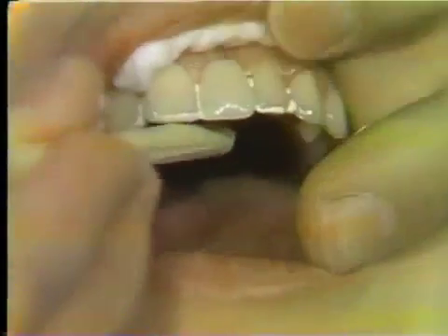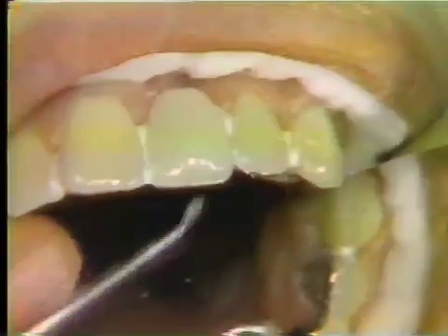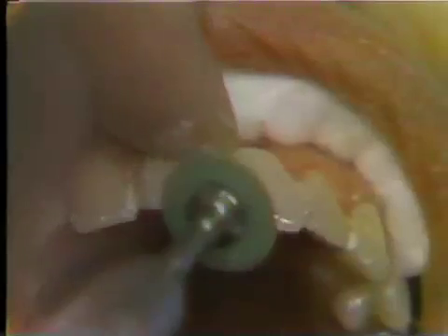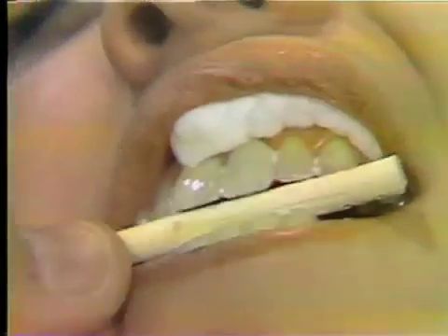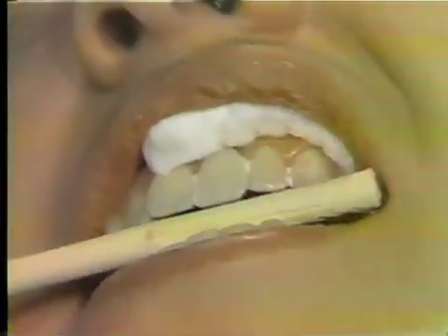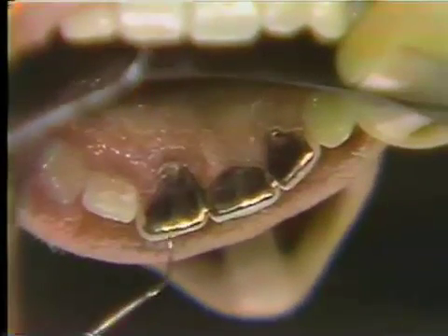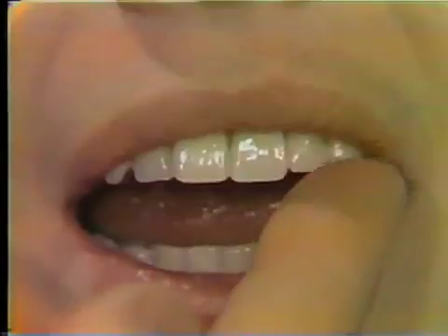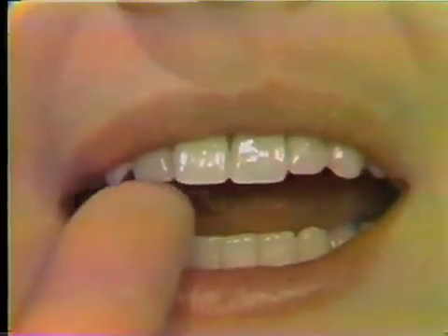We have a minimal amount of working time, so it's very important to drive this bridge down all the way, being careful not to fracture the incisal edge of the teeth. While the cement is still a little bit soft, the gold can be burnished over the incisal edge, and the thin areas around the cervical can be burnished with a fibrous burnisher. A fine emery disc is used to go from gold to tooth — to finish these margins on the incisal edge, dress them down, and round them so they don't reflect light. The patient is allowed to hold this bridge down for 10 minutes by biting on an orangewood stick. You can see the amount of gold on the incisal edge, yet when properly beveled from the front view, you cannot see this gold because it reflects the darkness of the mouth and looks very pleasing and aesthetic, giving the patient many years of service.